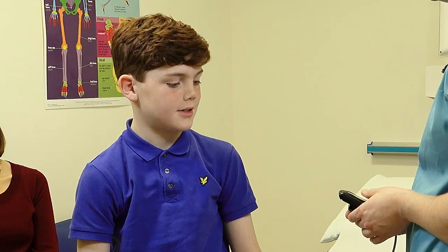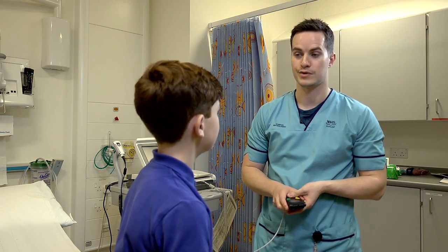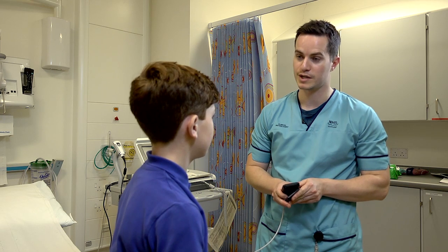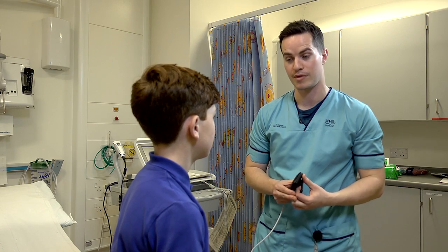How long do I need to wear the monitor for? Well, this monitor that you're wearing, you'll wear it for the next 24 hours — so until this time tomorrow. We do have other monitors that last for a longer period of time: some last for 48 hours, some last for a week, and we've even got ones that last for a month.